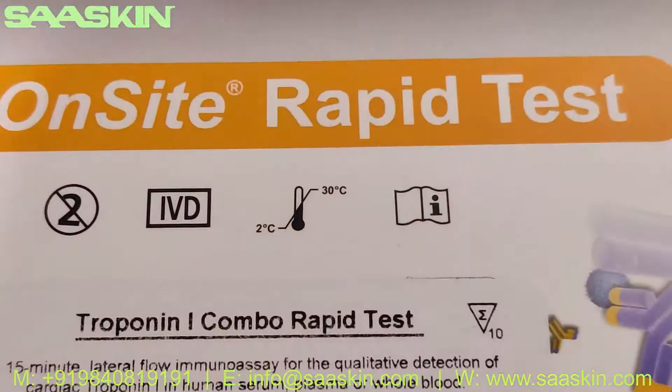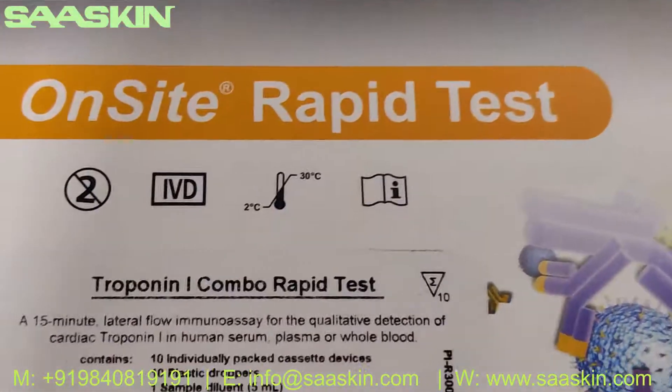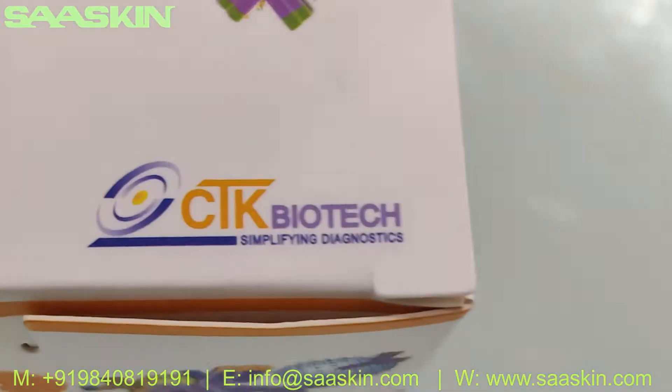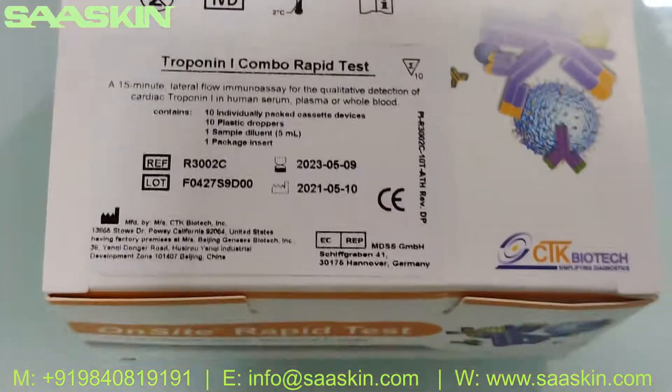This is the Troponin I Combo test. This is how the box looks like. It's a CTK Biotech Troponin I Combo rapid test kit, and this is a 10-test kit pack.